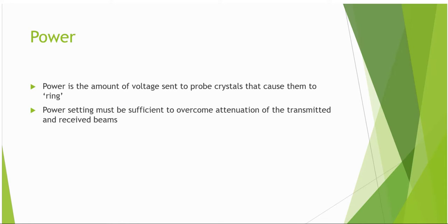The louder we ring the crystals by applying a larger voltage, the larger the delivered spatial pulse length. This affects our spatial resolution and specifically axial resolution. The ability to determine two structures as being separate vertically in the image is therefore modified.